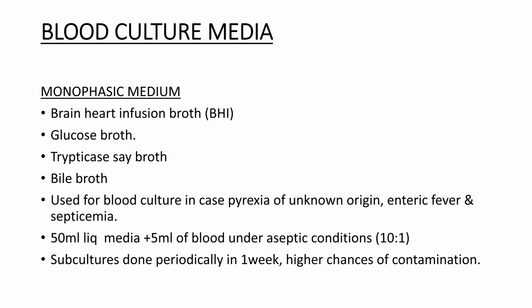Now, beta, we are going to discuss the blood culture media. It is very important in case of sepsis, or if the patient has a high grade fever, or is in septicemia, so we go for the blood culture, or in case of infective endocarditis too. Right? So what is there in blood culture media?